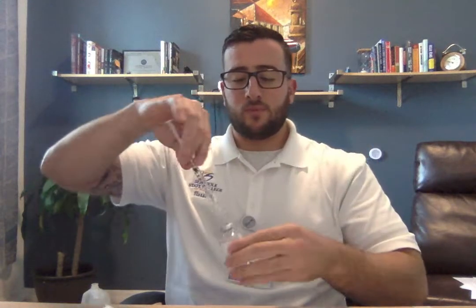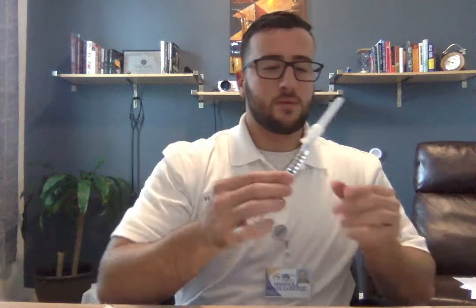All right, I'll flip it around. Okay, I'm going to recap my syringe. So it's recapped. Next thing I want to do is label, so I'm going to grab a piece of tape here.